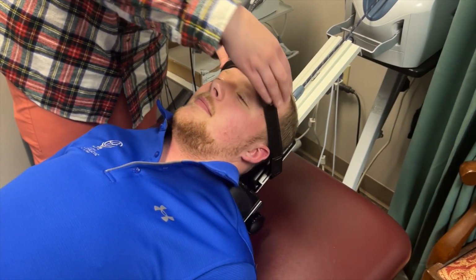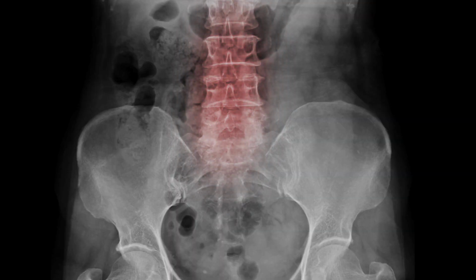When we talk about the decompression aspect of it and how it's affecting the disc, there's kind of an off-label usage on the decompression as well as the facet joints and the jamming and the compression that takes place on the facet joints themselves of the spine. The opening up and giving space between those facet joints is also a benefit.